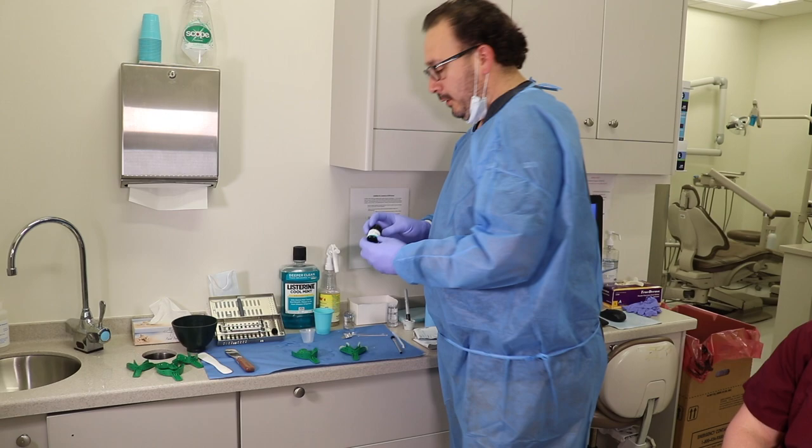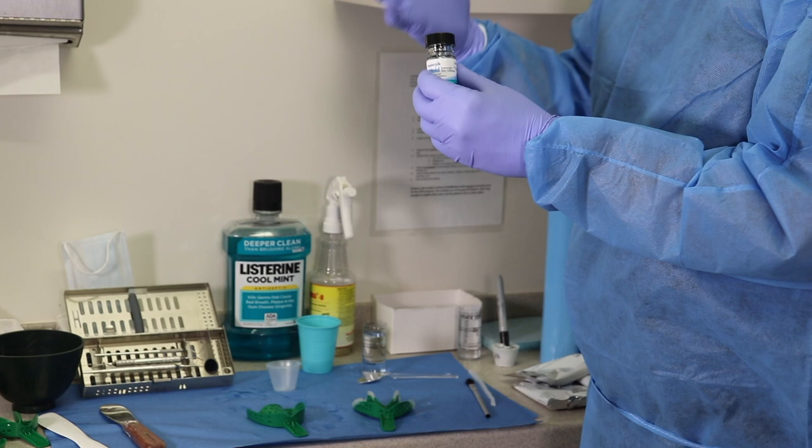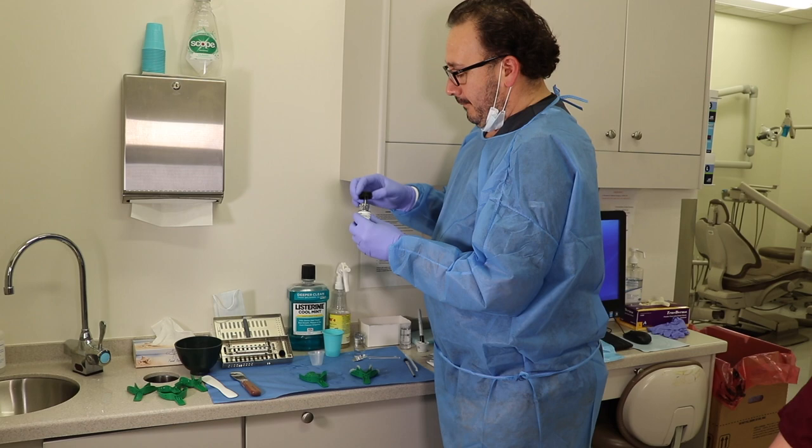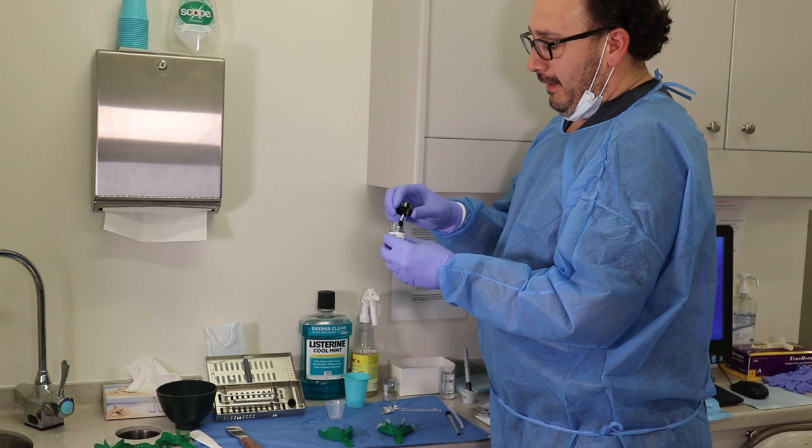The adhesive, it's a special adhesive for plastic trays and alginate. If you're using any other impression material, you need to use a compatible adhesive, okay? The adhesive comes with a special brush. But this brush, I'm not gonna use, because this tray has already been in the patient's mouth, so if I use this one, it would be like double dipping nachos in the Super Bowl, right?